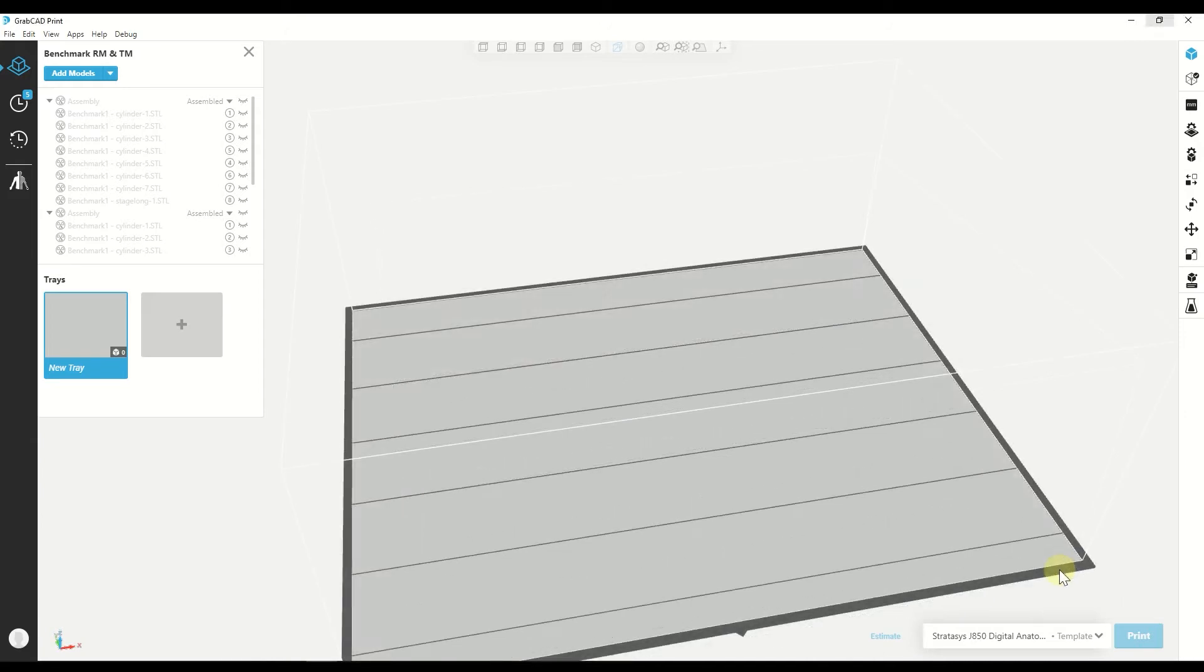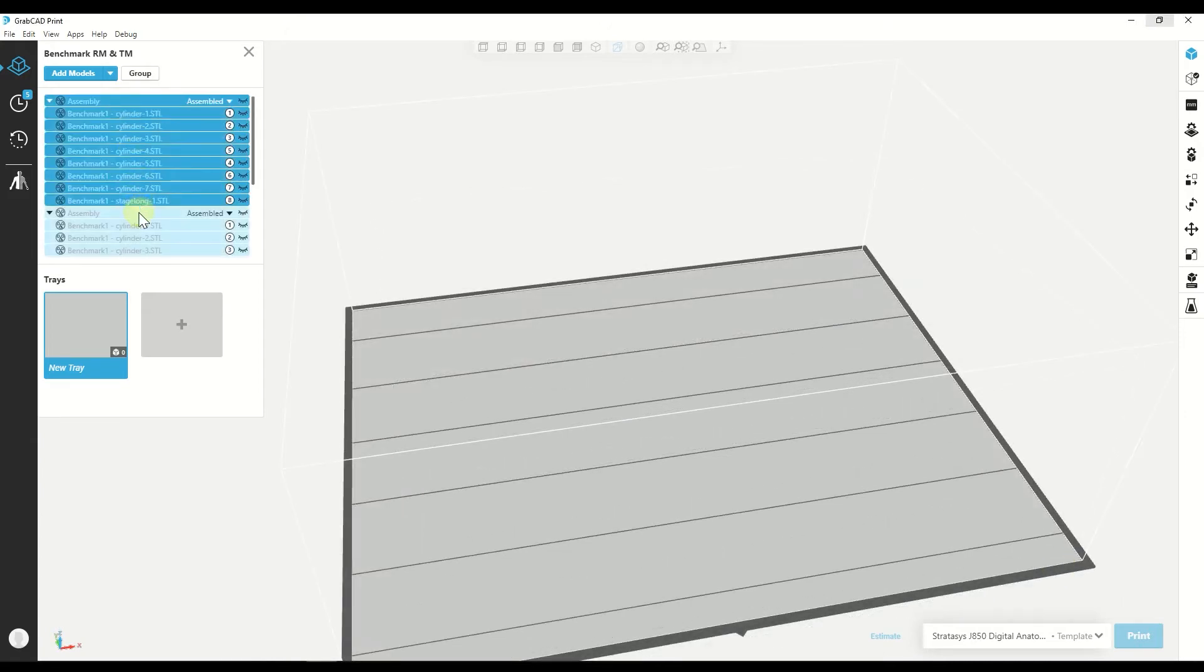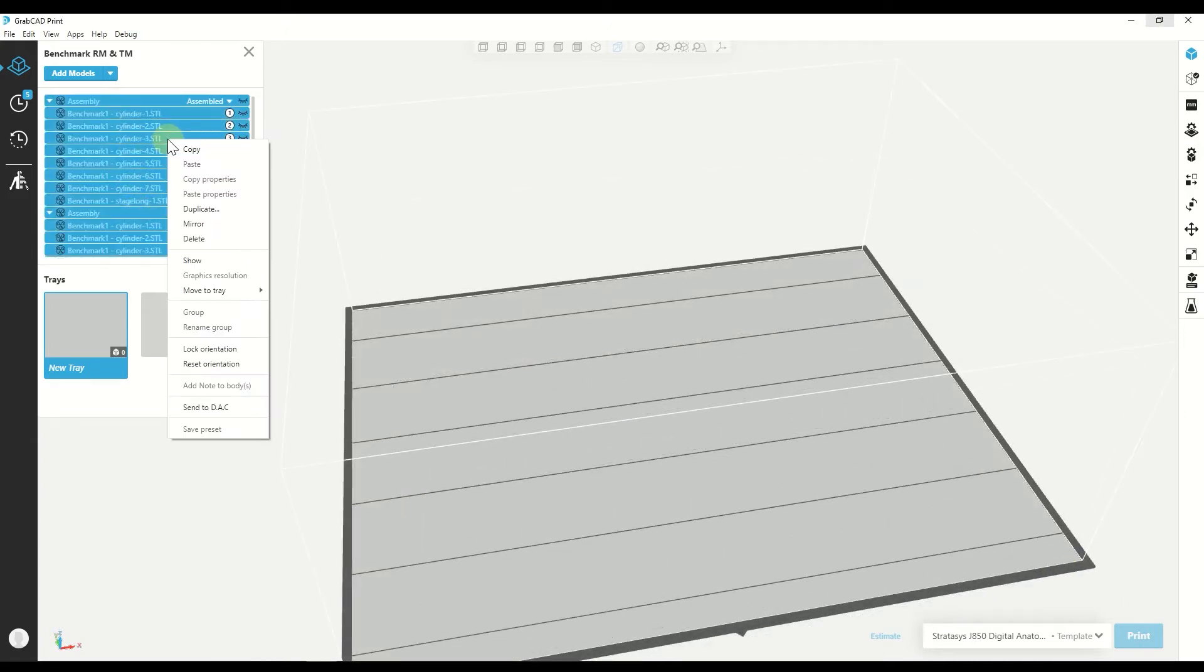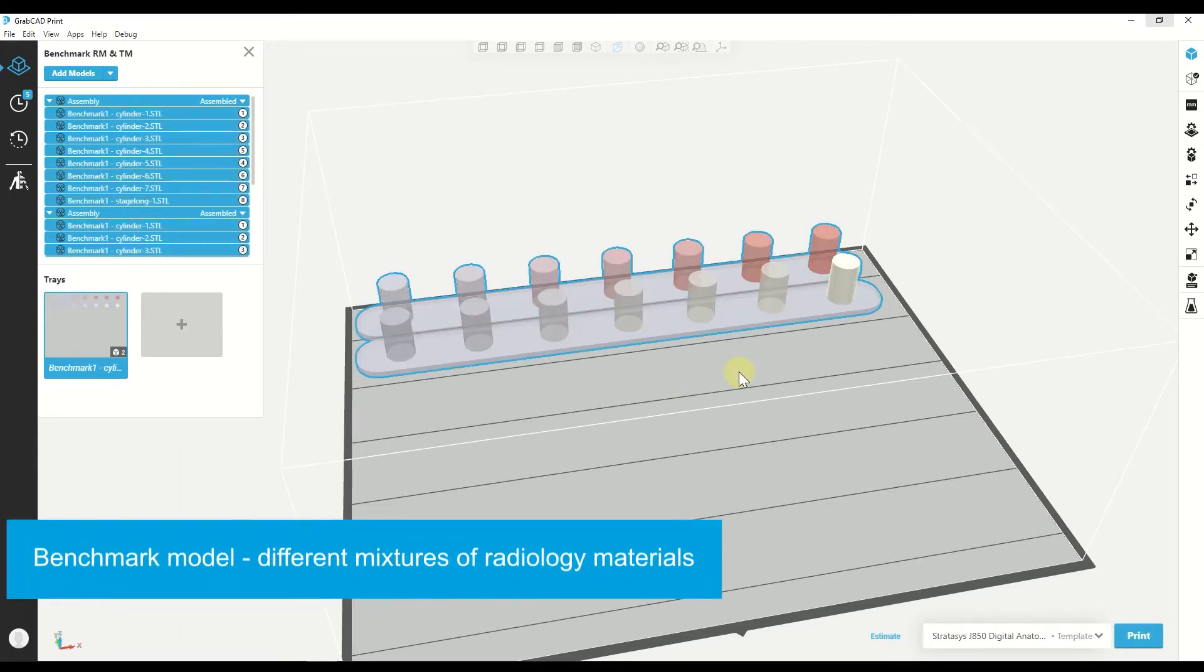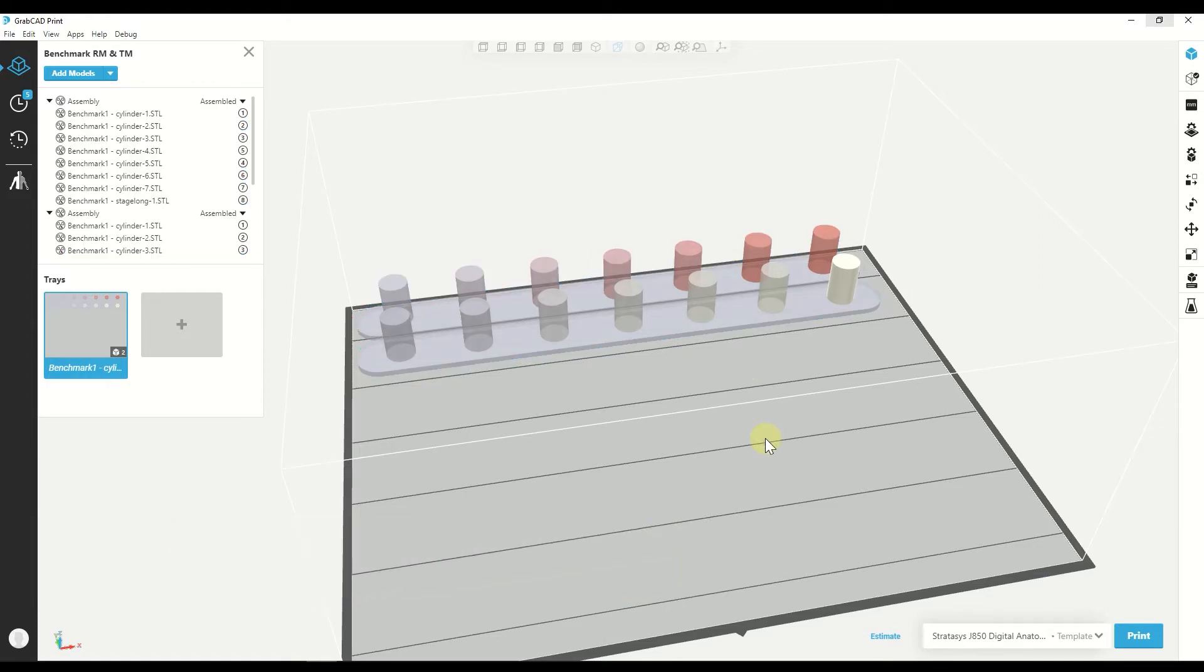So let's look at the first model. This is the benchmark model. It gathers different mixtures of Radiomatrix, Veroclear and tissue matrix that can help you understand the range of Hounsfield values that you can reach and the connection between the Hounsfield value and the material mixture.